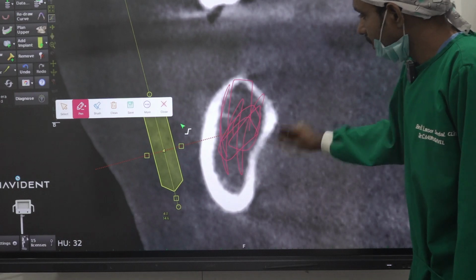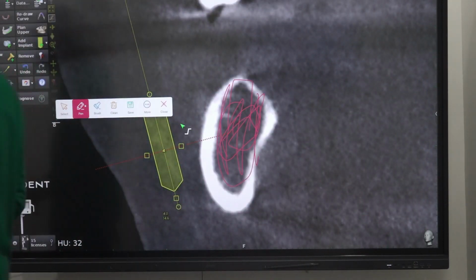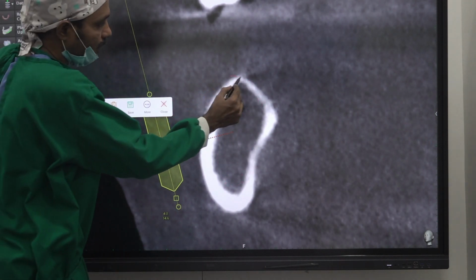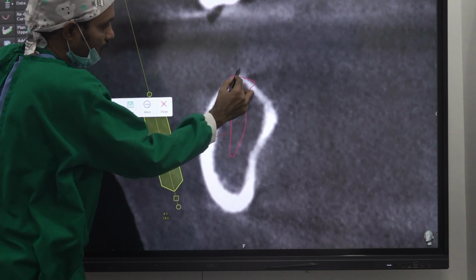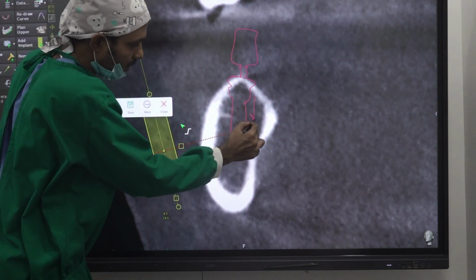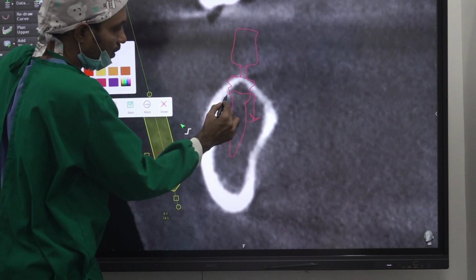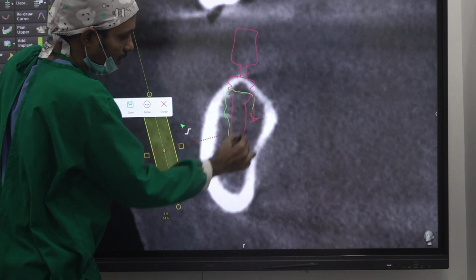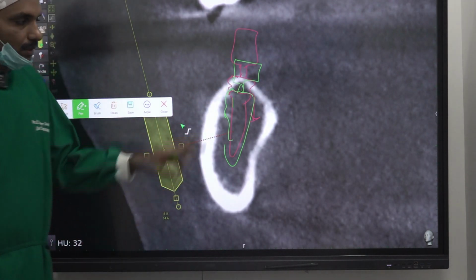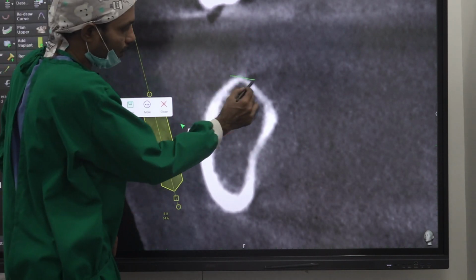If there is good bone, the implant won't slip like this. It is like a sinus cavity, the same thing. So even when we are placing a single piece implant, when the implant head is here, you will get some stability. But the moment you insert deeper, the implant head will come here. When this part goes below that crestal part, it will immediately become loose. So when we are placing a single piece implant, make sure you are not over inserting.